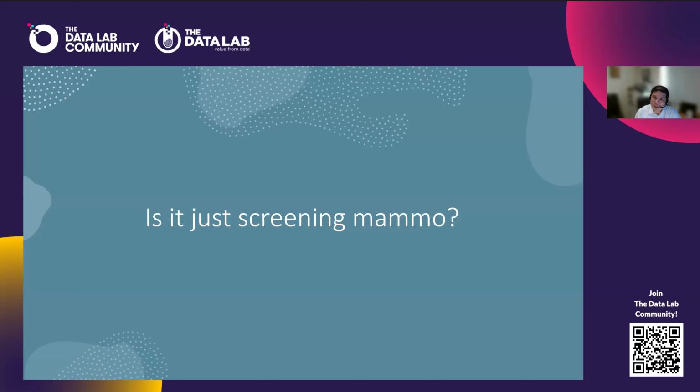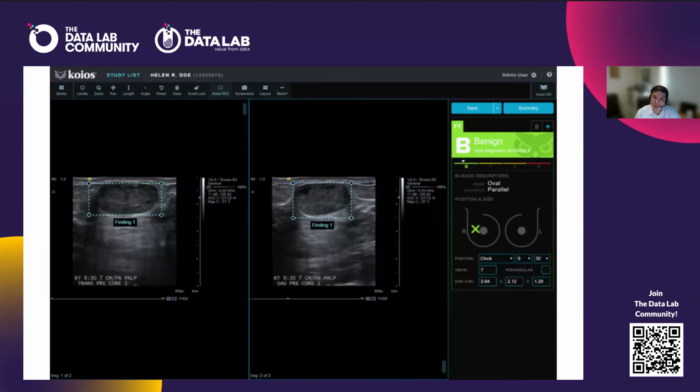And yes, we do use AI in other areas in the NHS. Breast ultrasound. There are a few centers using breast ultrasound with AI at the moment. Using that tool, we are trying to see if we can say AI says these are benign lesions, so no touch, no biopsy lesions. That's one of the areas we're doing, because most of us trained breast radiologists are very good at finding cancers already on ultrasound. So we're using different ways to leverage AI.